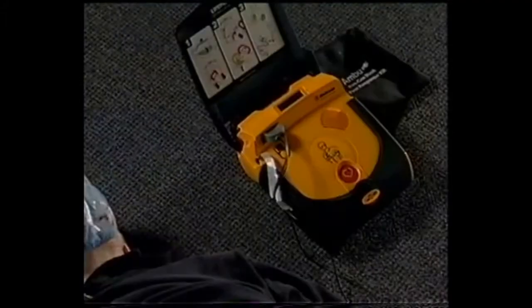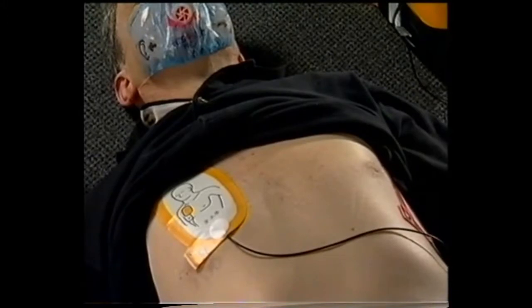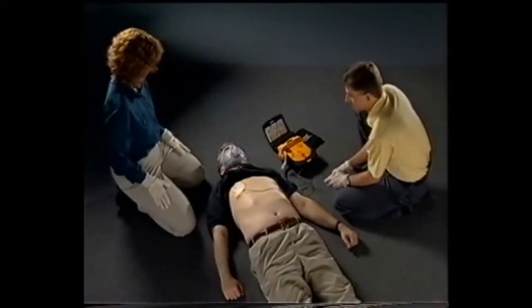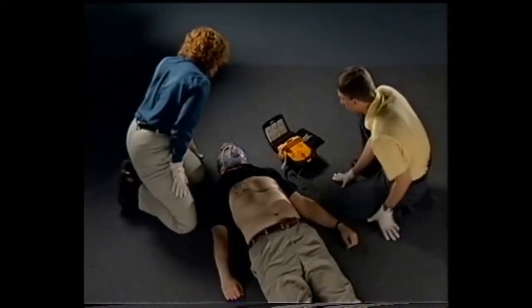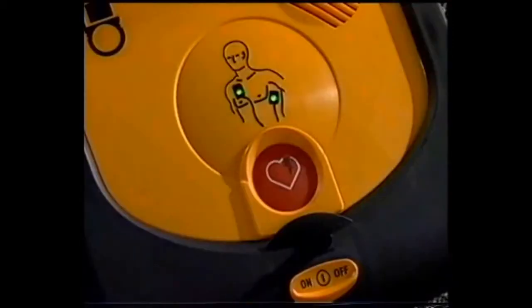"Evaluating heart rhythm." The defibrillator evaluates the patient's heart rhythm within 11 seconds. While it is doing that, do not touch the patient or the defibrillator. Doing so could interfere with the analysis. If the defibrillator detects a heart rhythm that requires a shock, it says, "Stand by. Preparing to shock." When charging is complete, it says, "Everyone clear."